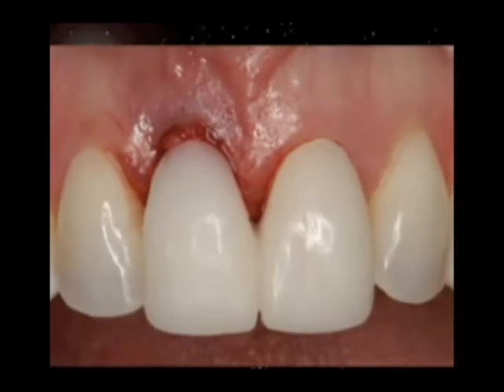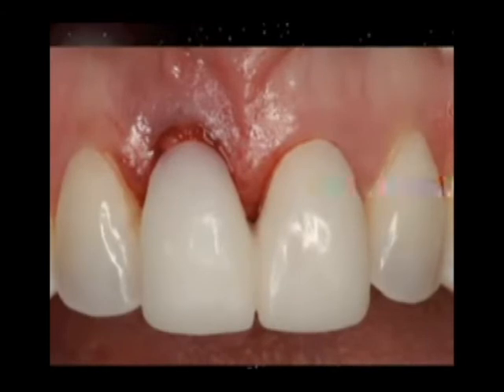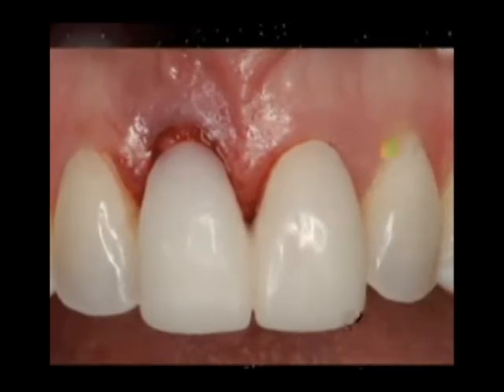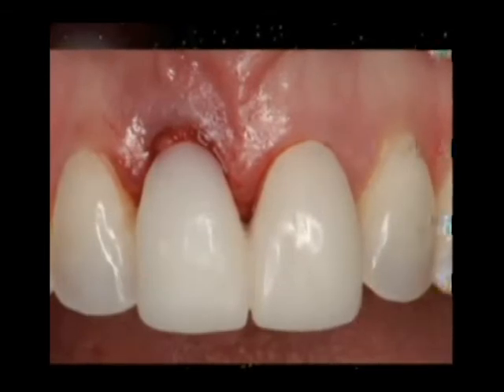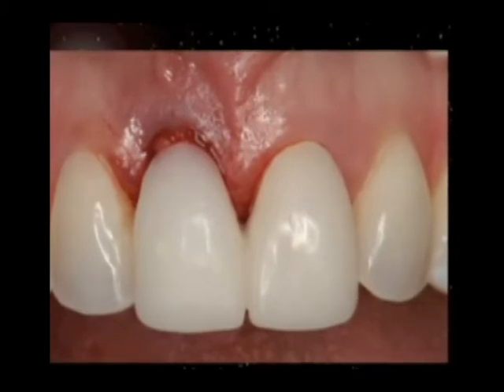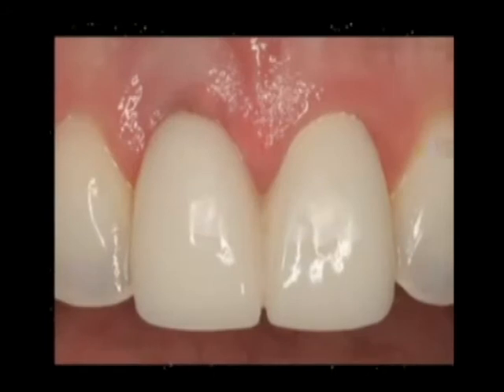There's no confusion, no questions, and the patient's fear and apprehension is greatly diminished because of the coordination and the predictability of the treatment. And here you can see the day of the implant placement and the provisional restoration placed on the implant and the natural tooth, and what healing occurs over several months' time.